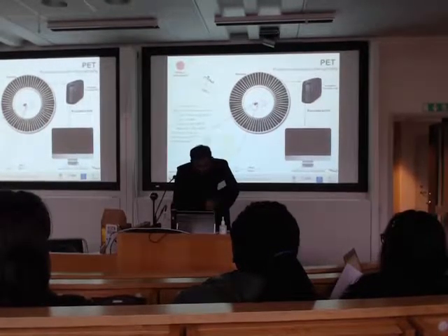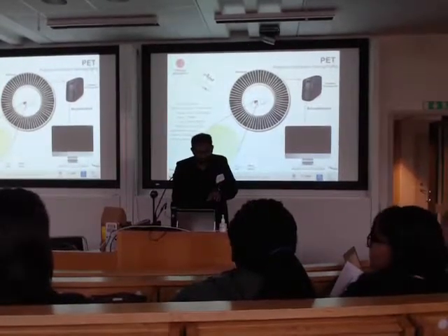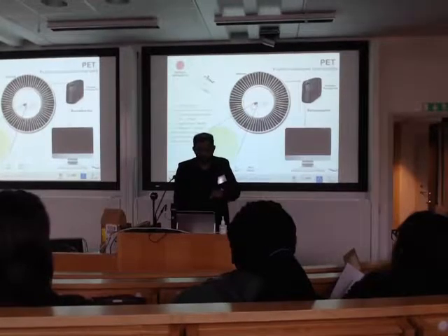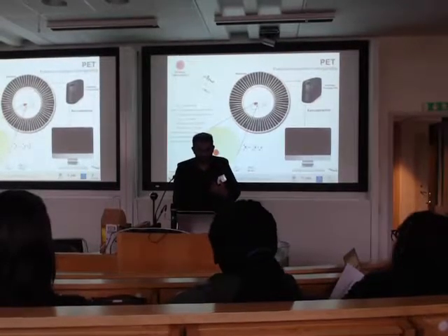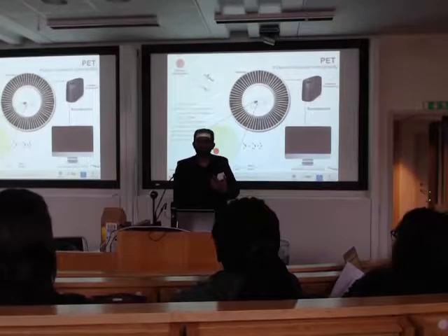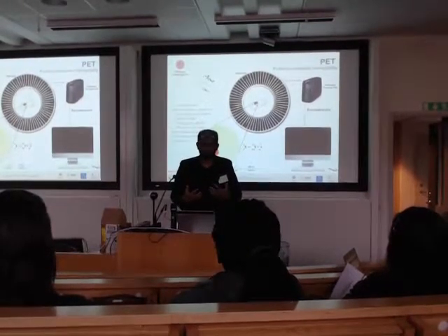So this is something special. The PET is something special. I just want to give a gist of how this PET actually works. Positron emission radionuclides, as you know, are unstable radionuclides. They get stability by converting a proton in the nucleus into a positron and a neutrino. This positron is nothing but a positively charged electron, so we are talking about an antimatter right here.